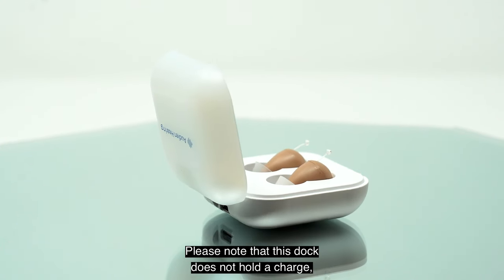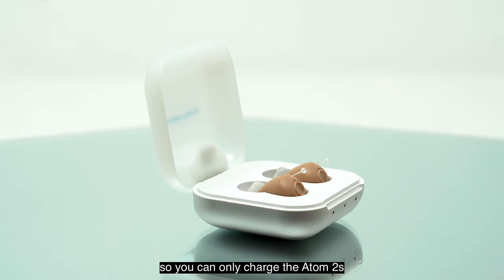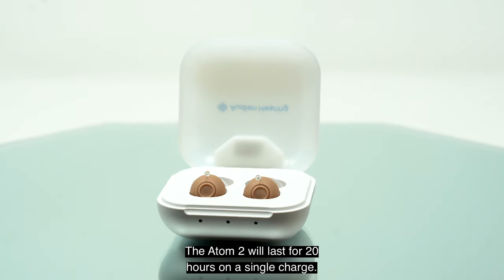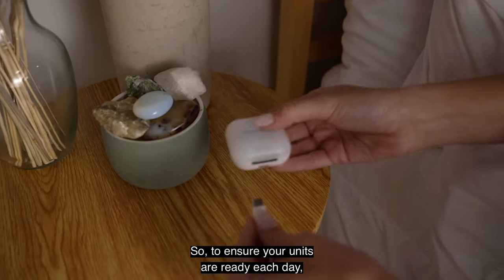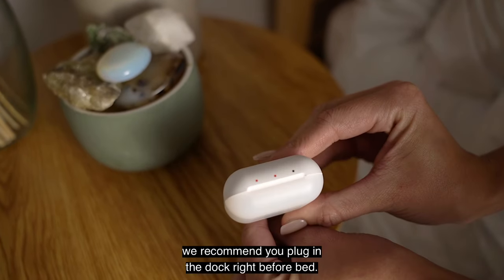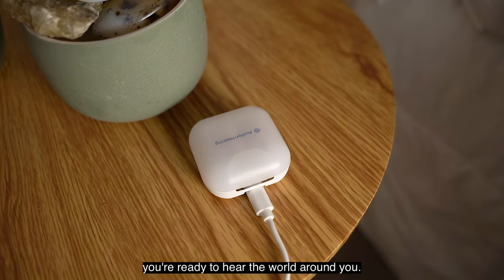Please note that this dock does not hold a charge, so you can only charge the Atom 2s when the dock is plugged in. The Atom 2 will last for 20 hours on a single charge, so to ensure your units are ready each day, we recommend you plug in the dock right before bed. That way, in the morning, you're ready to hear the world around you.